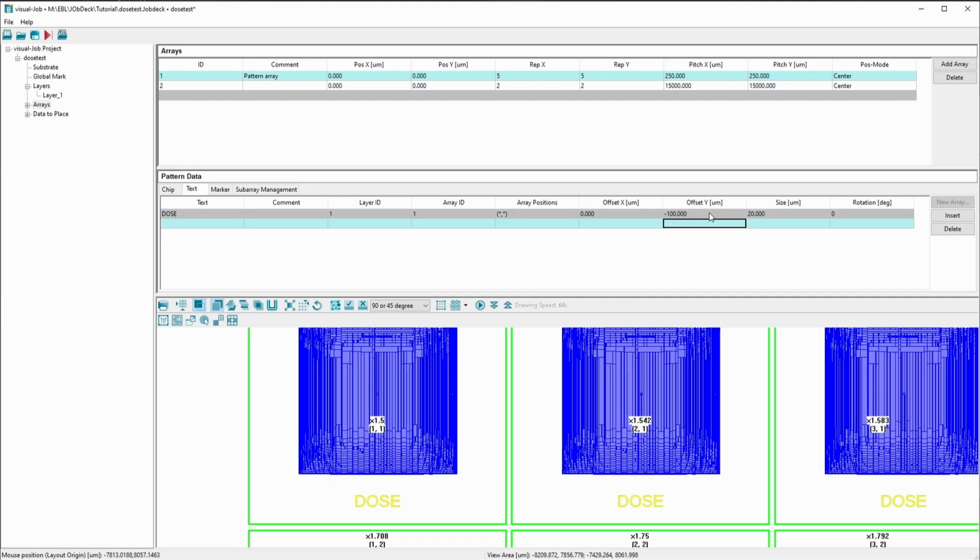So now the dose label is in a good position, but currently it just says dose, so it doesn't do much good yet. So in order to get a dose inside this label, instead of just some letters, inside the $ signs, you would write dose underscore rel, and this would then put the relative dose as the dose label. There's of course a problem with the accuracy. We can fix that by explicitly asking for 3 decimal points. So we add parenthesis 3. And now we have the precision to 3 decimal places.